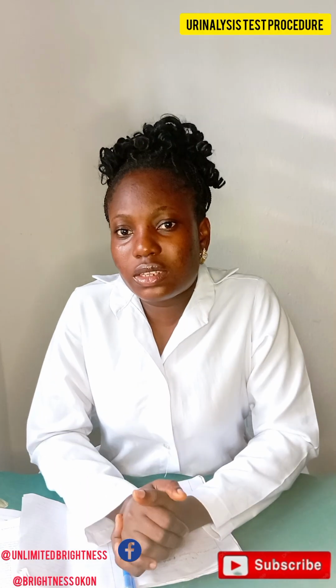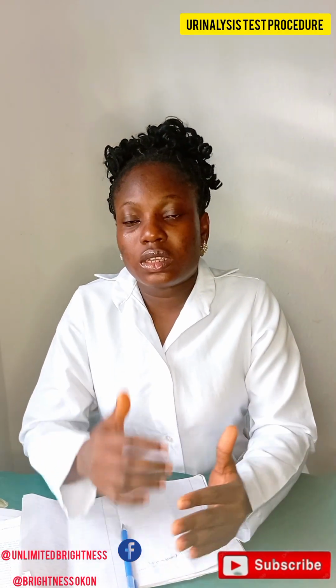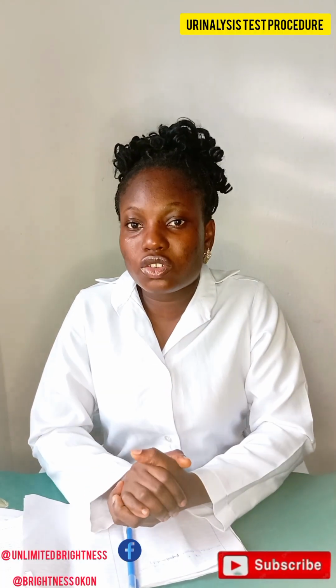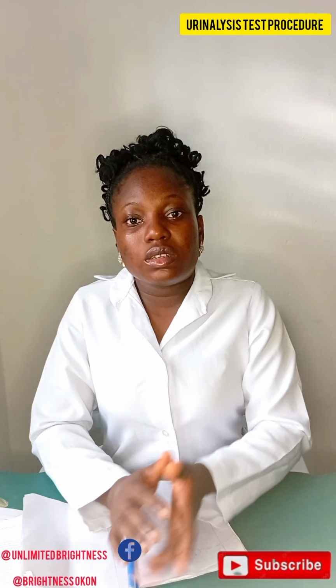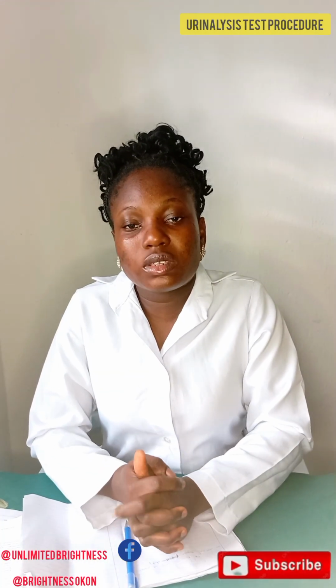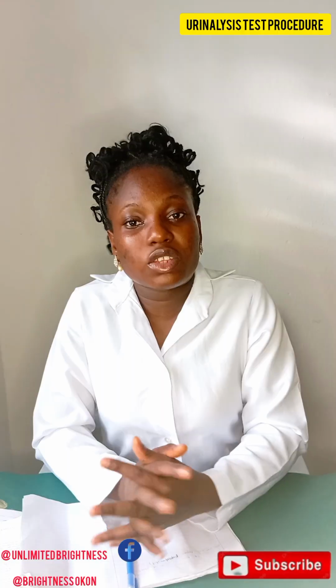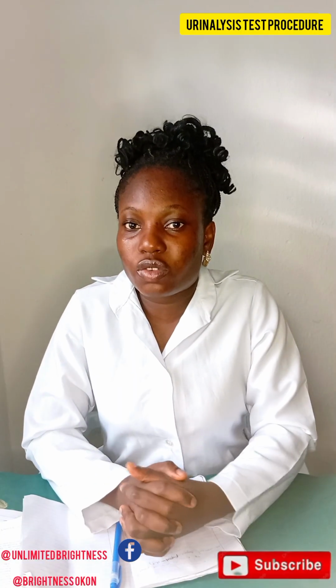So this urinalysis test has different phases of carrying out the test. Number one is the macroscopic examination, which is the physical examination of the urine sample. Different colors of urine samples determine the conditions in which our internal organs are functioning.